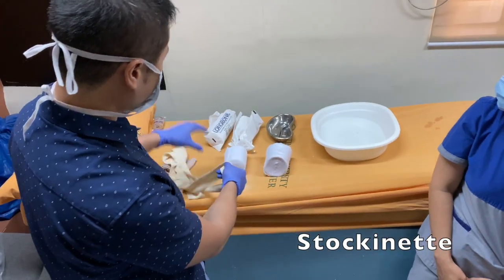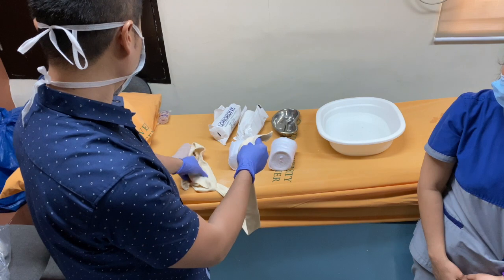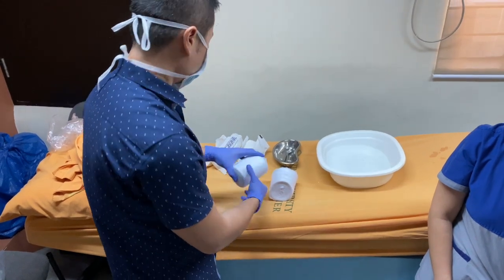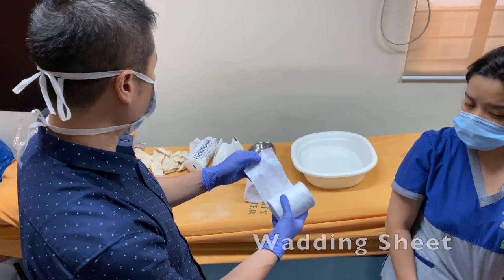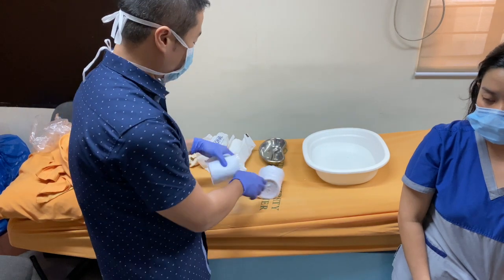A stockinette — this is a two-inch stockinette, which is appropriate for the size of our patient. This is the one contacting the skin, which can lessen the irritation. We also use the wadding sheet, which will serve as the padding for the forearm and for the skin, and also as padding for the cast that we make.